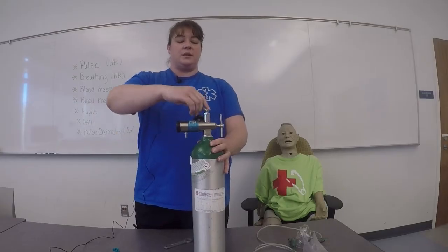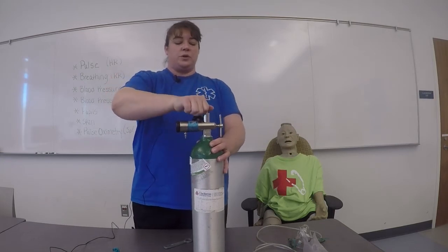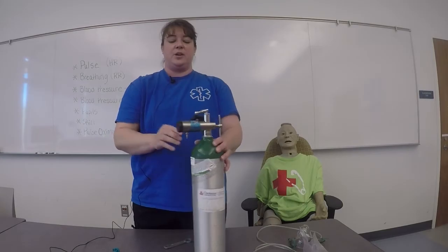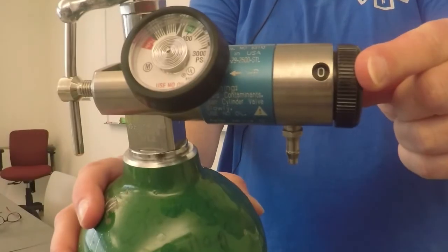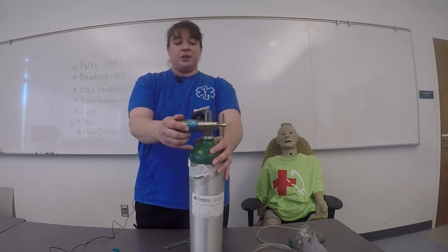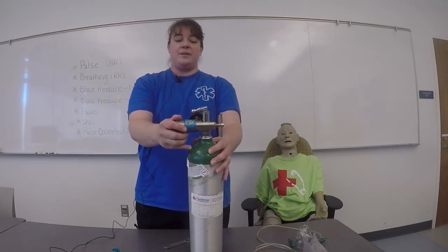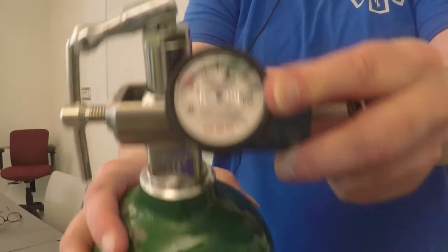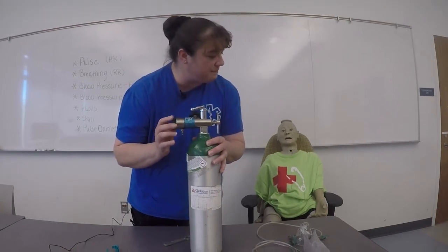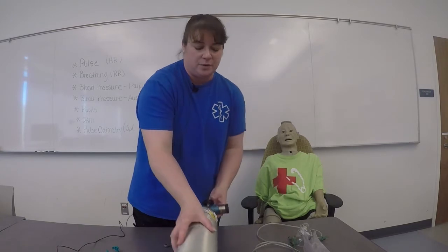I'm then going to turn the tank one quarter turn with the regulator on zero and check for tank pressure. I'm currently at 2,000 PSI — this is a full tank. I'm going to check for any leaks. I hear none. I'm then going to lay the tank down for safety.